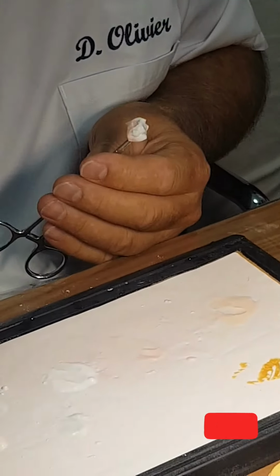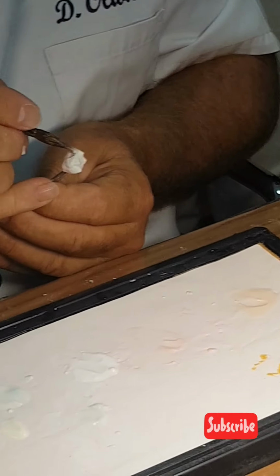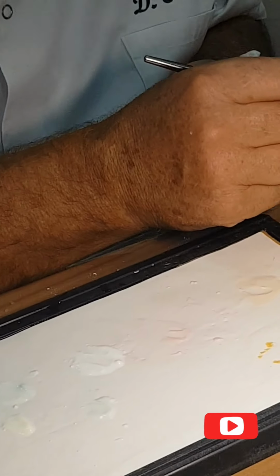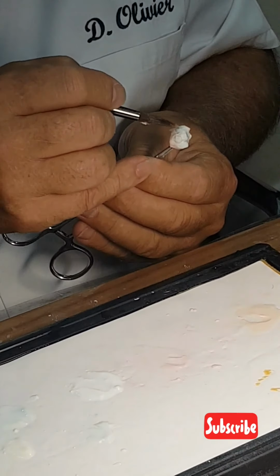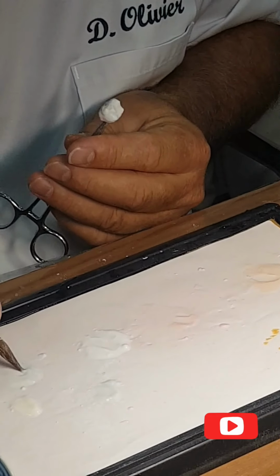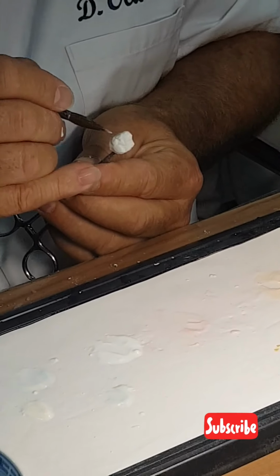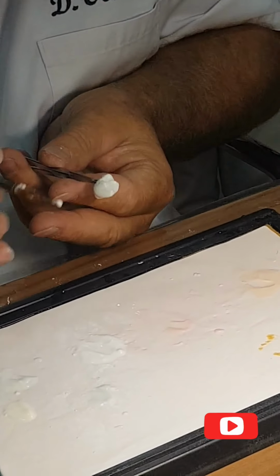The contact point over with my enamel. In distal area too.